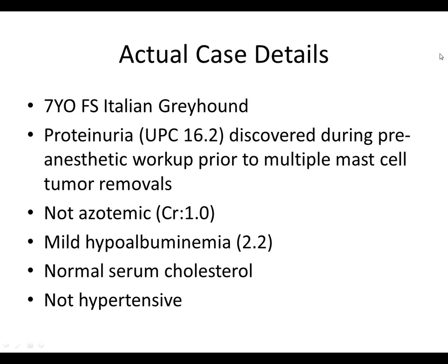So whether or not these are circulating immune complexes that just get pushed into the mesangium, or whether you're actually making antibodies against mesangial proteins, it's really hard to say. I do think these are often kind of a chunky deposit as opposed to really good granularity. So again, we just don't have enough data right now to know the pathogenesis in dogs. We have a very small set of these cases, period, in dogs, and nobody has gotten beyond just recognizing that they exist in terms of figuring out pathogenesis or its implications.